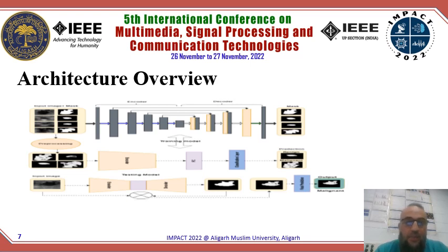As it appears here, we depend on the texture features. So we multiply the segmented part with the original image, and train our model on this texture part to finally classify whether it is malignant or benign.